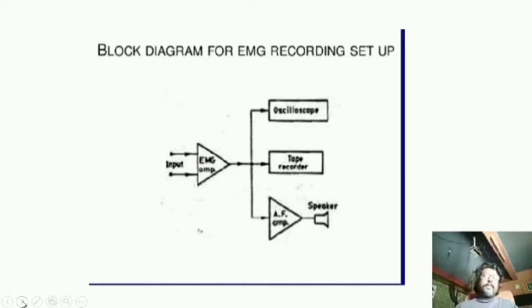And also I have mentioned in my previous slides that this EMG can be recorded or displayed in the form of an oscilloscope, and recorded using magnetic tapes. We call it a tape recorder. And not only that, the most unique thing is we can convert this EMG into murmurs or audio. So it can be heard in a speaker, and this murmur sound gives you the diagnostic values. These murmur sounds will reveal how effectively this muscle has been useful for conduction of any muscle activity or any action potentials.